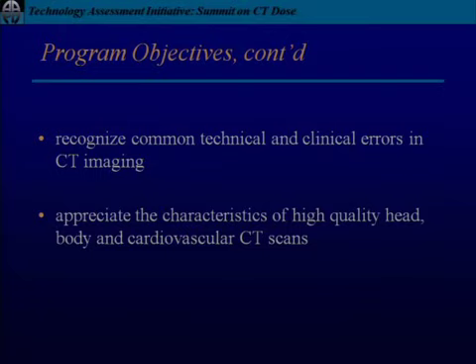recommendation really more for everybody under 18 years of age being pediatric, but then there are these pediatric patients who are much bigger than me. So obviously you would not use that. For head, it actually matters less, and we're doing more and more MRI scanning instead of head CT. So it's only really for trauma imaging that we use head CT, and there we are really looking for two things. We are looking for intracranial hemorrhage, and we're looking for fractures within the calvarium, and there you can actually reduce the mAs to half the value without losing.